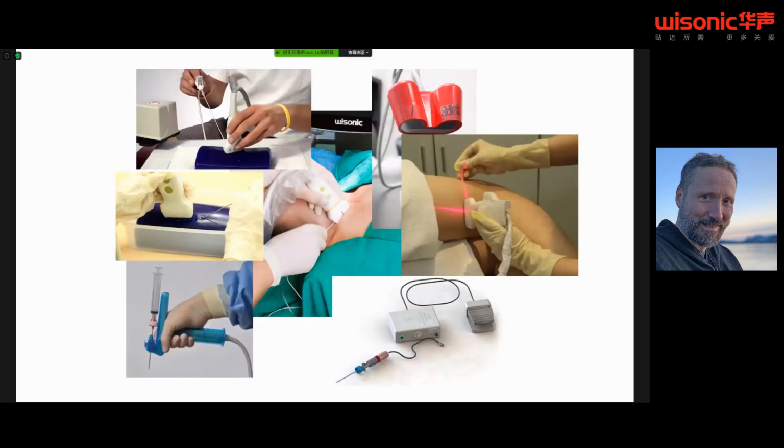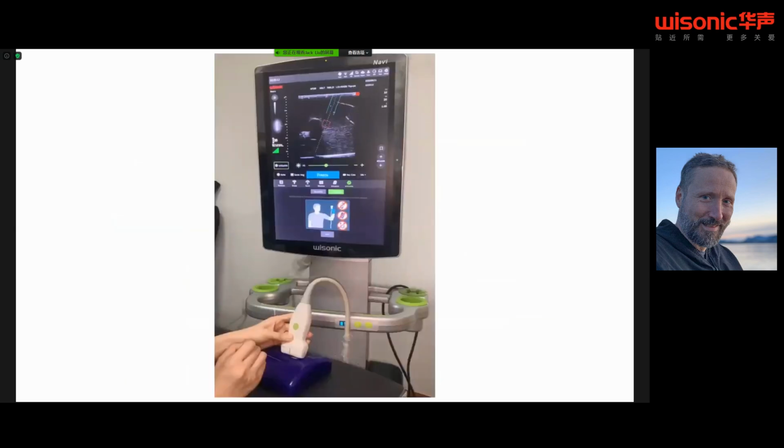There is a variety of needle tracking systems that can be used to improve needle control. Some of them use an electromagnetic field, there are optical systems, there are mechanical devices. All of them potentially might facilitate the identification and visualization of the needle during an ultrasound-guided block procedure.